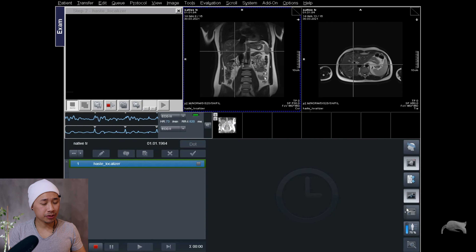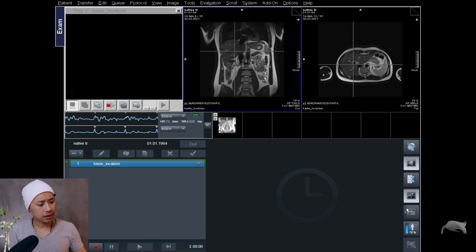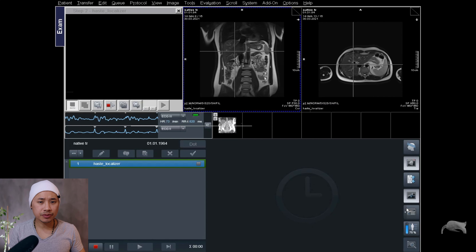Recently I had a cardiac examination and I went into the sequence library to check what sequences are available, and I found this specific sequence which I think can be useful — because when I'm talking about a localizer, I want it to be fast, efficient, and easy to use, and to provide a good overview on how to position my slices. So enough talking, let's go and I will show you.